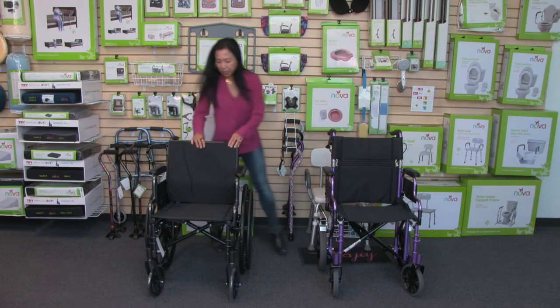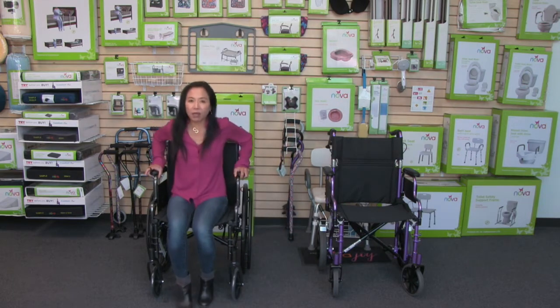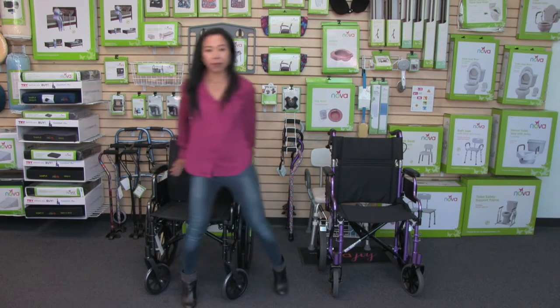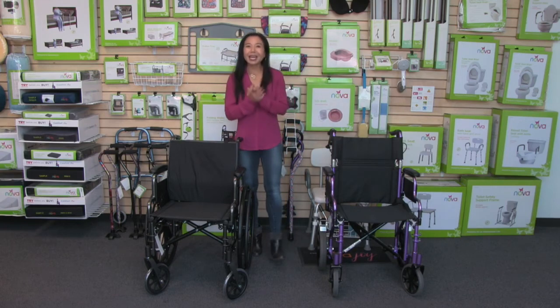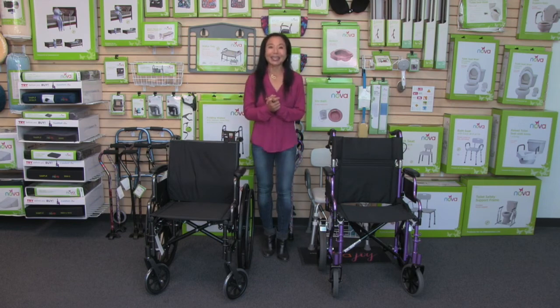Now sitting on the chair, I've got not just cushion but lumbar support on my lower back. This cushion comes in a 16-inch width and also an 18-inch width, and as with all of our products it comes with our care, use, and contact information so you can reach out to us anytime.